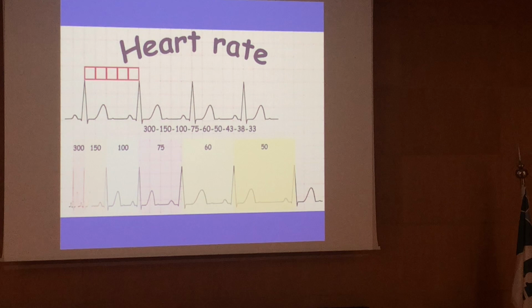If it is irregular, how to calculate the heart rate? So suppose somebody with atrial fibrillation, RR is very changing. So how to calculate the heart rate in that case? The best way is to take the ECG, usually 10 seconds. So take 10 seconds, see how many QRS complexes in that 10 seconds. So if, for example, 1, 2, 3, 4, 5, 6 in 10 seconds. So in 1 minute, how many? I multiply by 6, right? Because I want 1 minute, I have only 10 seconds.